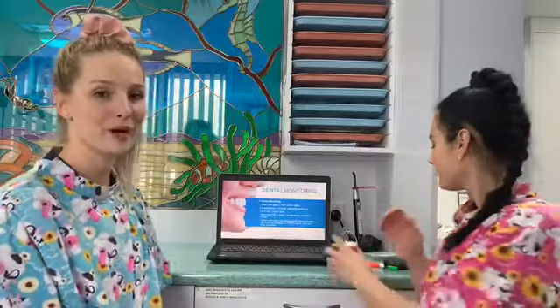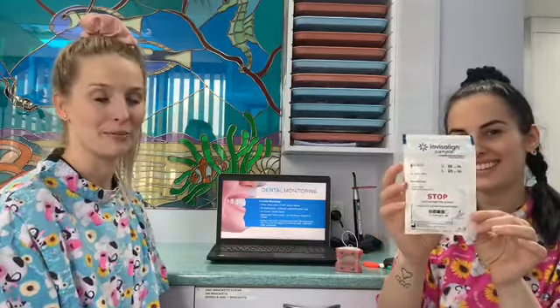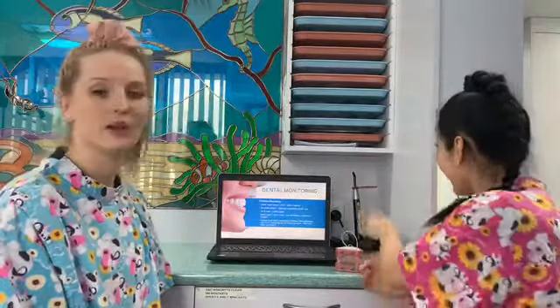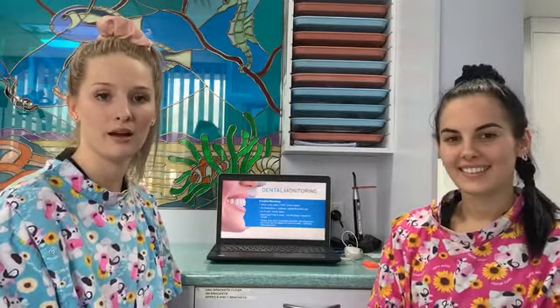So never move past a stop sticker. On your aligners you will find a stop sticker on some of them. So it's really important that we don't move past this aligner. We can move into it, just don't move past it, because it might mean that you need some of that IPR, or we might need to start some elastics.